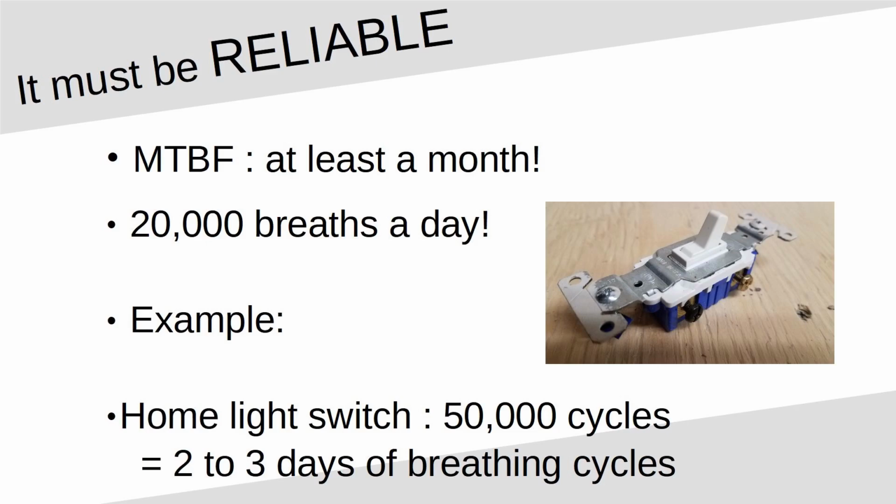Why is that important? Well, if it fails very often, you're going to put somebody's life at risk, of course. The other thing is, if it fails every 2 weeks, you're going to need a huge team of ventilator repair people. And in the end, you're going to spend all your time fixing ventilators as opposed to making more ventilators. And that's probably not a good situation.